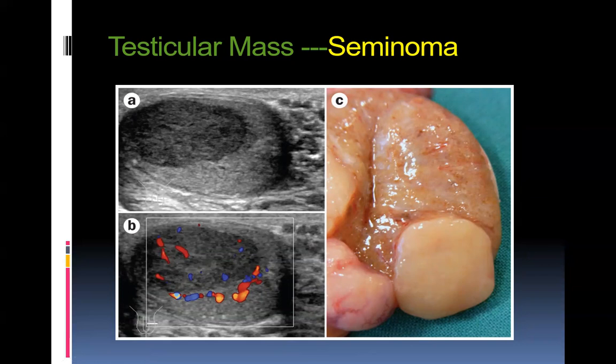So ultrasound is an imaging modality of choice when it comes to evaluating the superficial structures, especially the epididymis and testes in adults. And prostate, as I've said, you can do it with ultrasound, but with multi-parametric imaging available these days, MR, you can plan out a better study and you can sort of stage the tumor according to that. And obviously, with the results that you get, sometimes you need to biopsy these cases. Obviously, you need to know what stage it is.